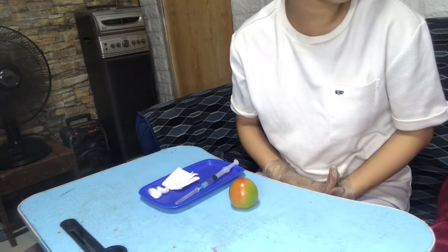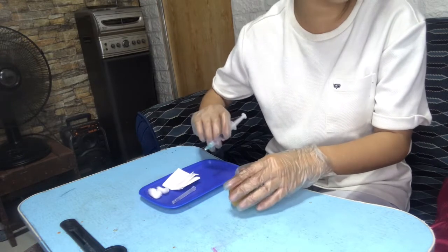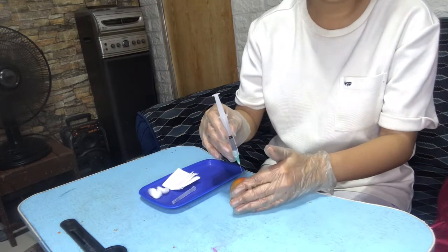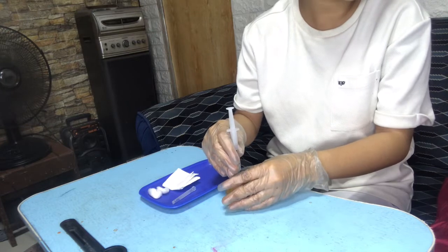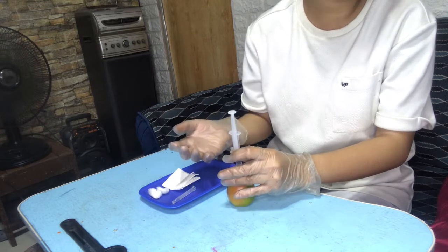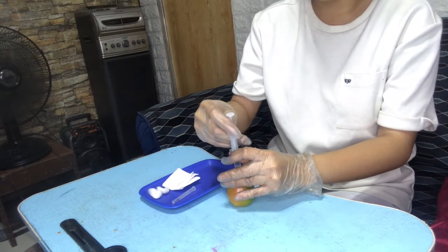Remove the needle cover and discard it without contaminating the needle. Let's remove the needle, and we're going to do the Z-track technique. Holding the syringe between the thumb and forefinger as if you're holding a pen, pierce the skin quickly and smoothly at a 90-degree angle. Next, hold the barrel of the syringe steady with your non-dominant hand and aspirate by pulling back the plunger with your dominant hand. Aspirate for 5 seconds.